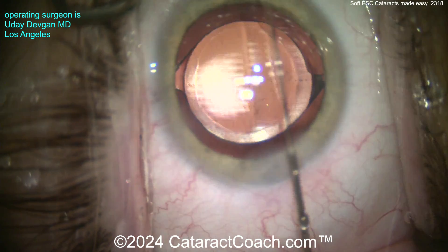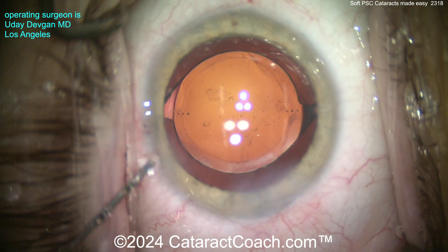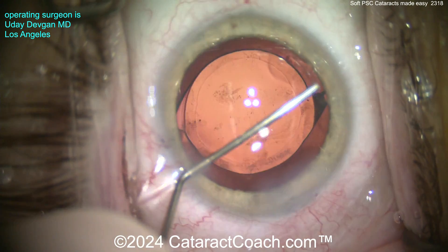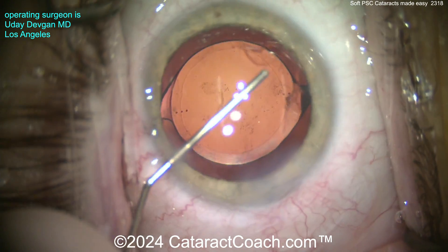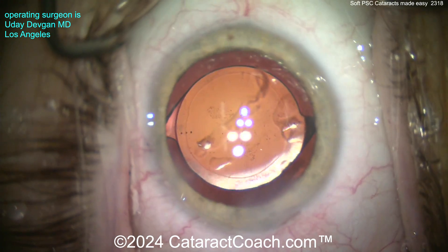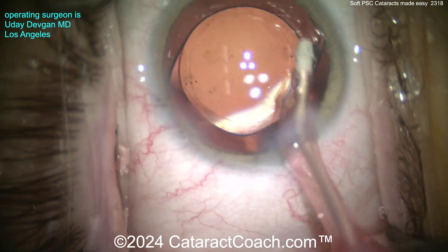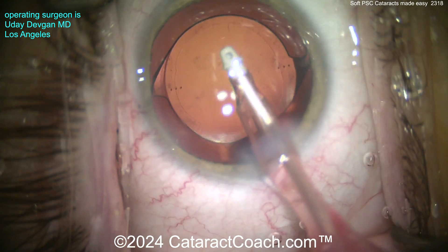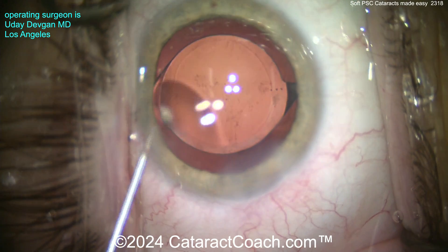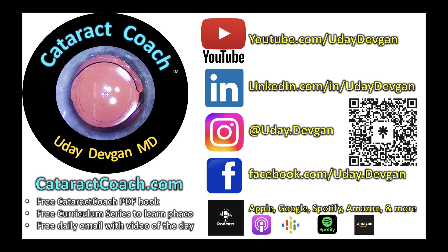Now sealing up the incision. This patient, on the younger side, is going to get a YAG laser capsulotomy anyway, so I'm not too concerned — if there's a little bit of material back there, we can always do a YAG at least three months after the initial surgery. There are ways of doing a power wash or further polishing of that posterior capsule, but keep in mind it's a young patient and that posterior capsule is only four microns thick — we've got to be careful. A little more removal of viscoelastic fragments, and we seal this up.